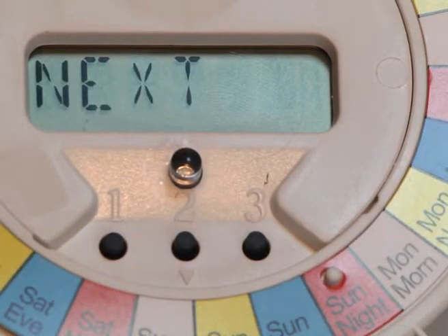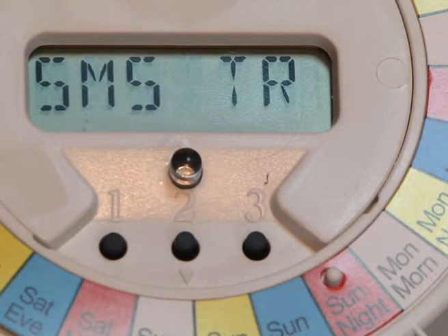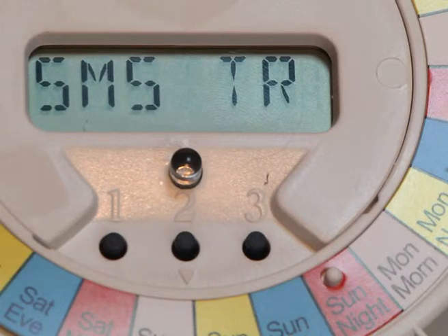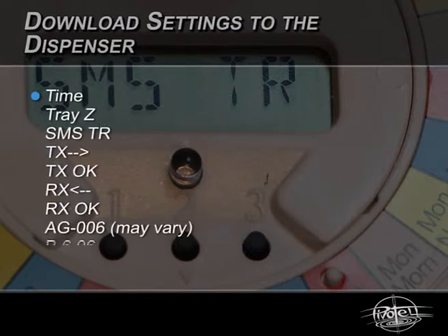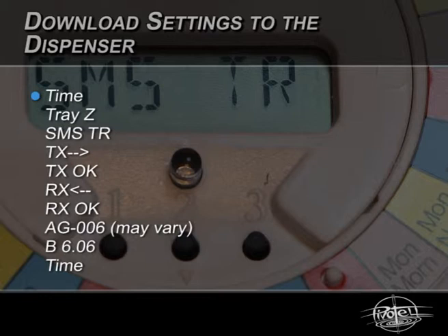The dispenser will contact the Administration Centre and exchange data, including telephone numbers and all the dispenser settings. The display will move through the sequence shown here. Once the dispenser has reverted to the clock, the programming is completed.